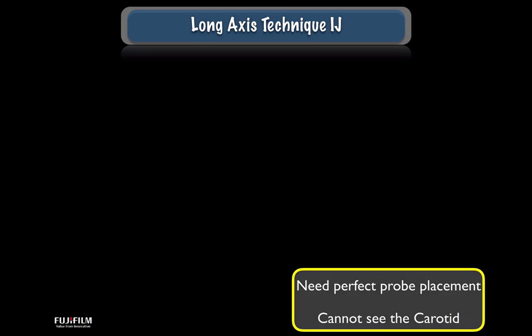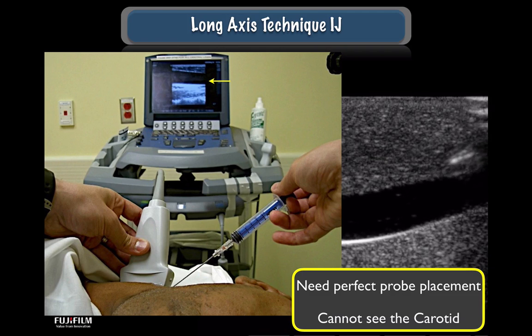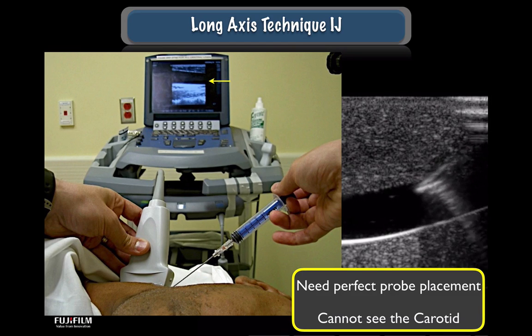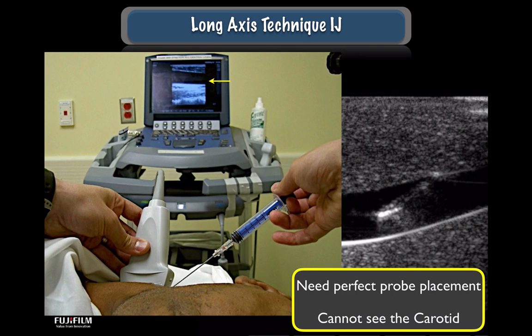So the long axis technique is a great technique. The problem is that you need perfect probe placement. If you slide your probe back and forth, you will miss the IJ. And again, you can see this is the point of view of the provider. You can clearly see that you're coming in this long axis, and on the screen you can see the IJ. You can see here, this is on a phantom, that needle's coming in. Again, visualizing the needle as it comes in. You can see that if you're not comfortable visualizing the needle all the way through, you could be off axis and puncture the carotid or puncture the thyroid.